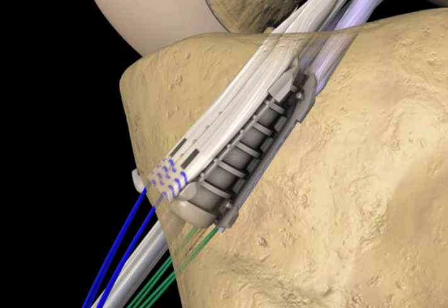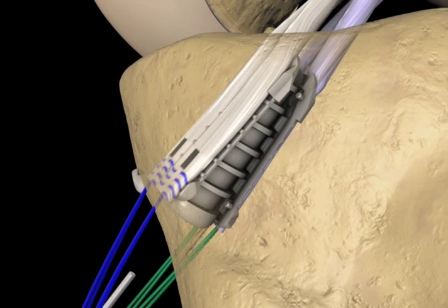Once the tibial implant is completely deployed, the inserter is disengaged and pulled out of the operative site. The guide wire is then removed.